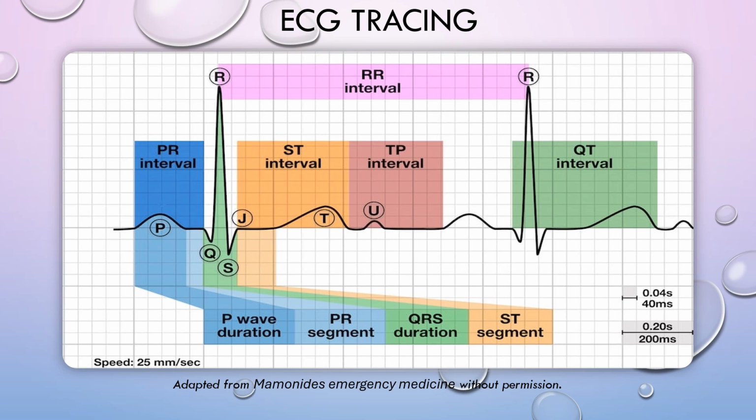So that is the ECG tracing. And here you're shown the electrical activity of the heart as it passes across the atria with a P wave. It goes to the QRS complex, which shows ventricular depolarization, and then the T wave, which shows ventricular repolarization, and then the U wave, which shows ventricular after depolarization. A lot of reasons have been adduced for the origin of the U wave, but one of them is that there's ventricular after depolarization, or the Purkinje fibers are getting a late depolarization, so to speak.